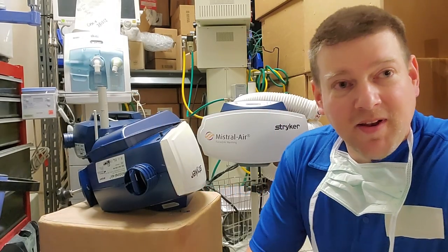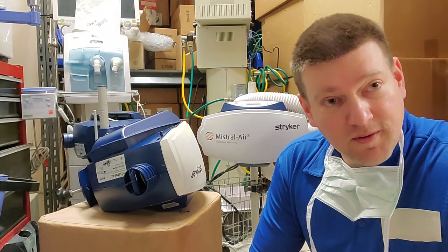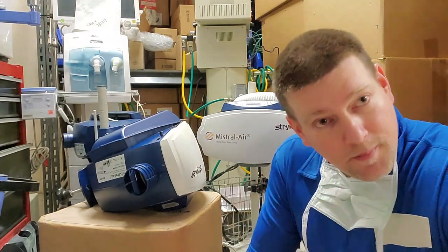Hey guys, welcome back to BetterBioMed. Today we're going to cover a simpler device that you're going to find throughout the whole entire medical facility. This is the forced air blanket patient heater.